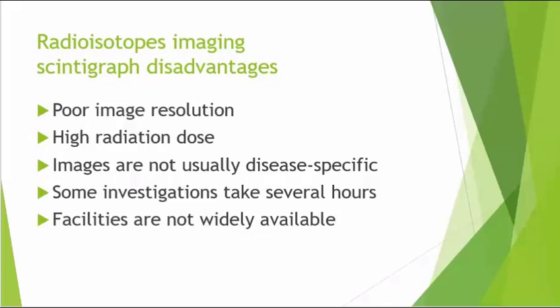Scintigraphy disadvantages. First, poor image resolution, minimum information about target tissue anatomy. Second, high radiation dose. Third, images are not usually disease specific. Fourth, some investigation takes several hours to do. And fifth, facilities are not widely available.